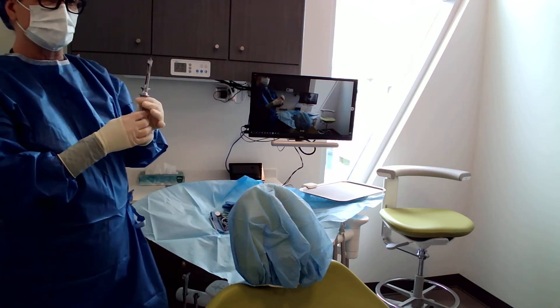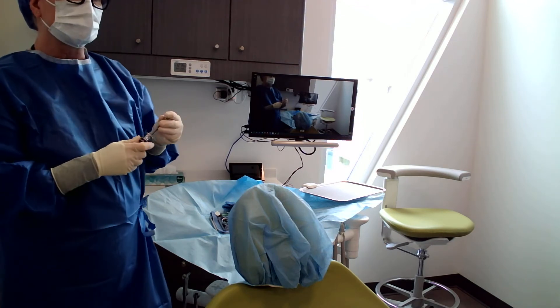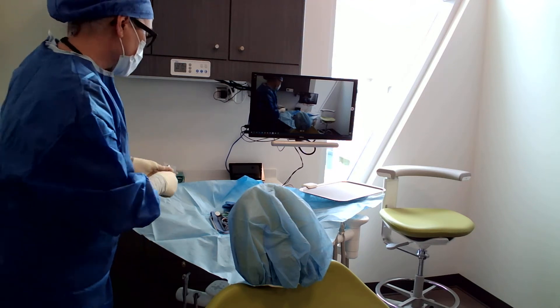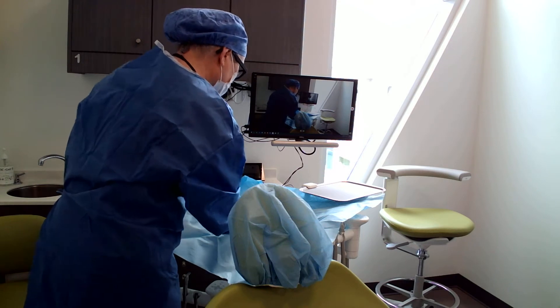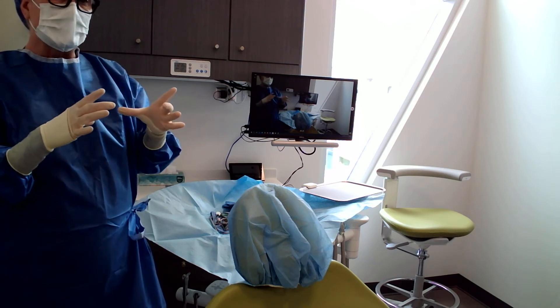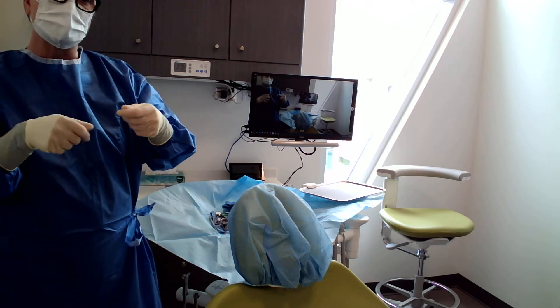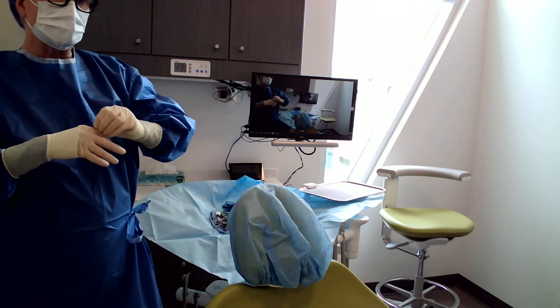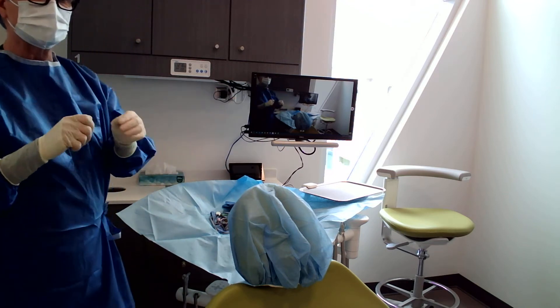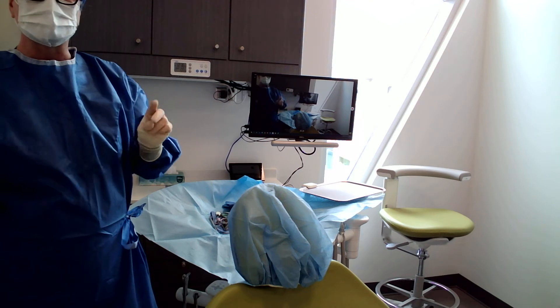Even though our patient Courtney got anesthetic in pre-op, I'm still going to set up the local for the surgery just in case she needs a little top-up. I don't have sterile carpules of anesthetic here, but we order them in boxes. Some offices, for clean procedures, pop them all out into a drawer. For surgery, you have to leave them in those sterile packages and pop them out as you need them. Once we've opened that package, we can only use it once for an implant.